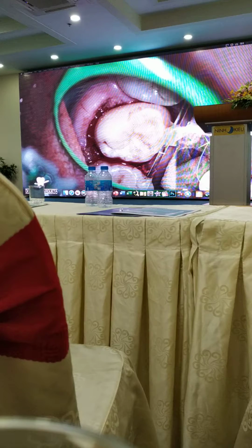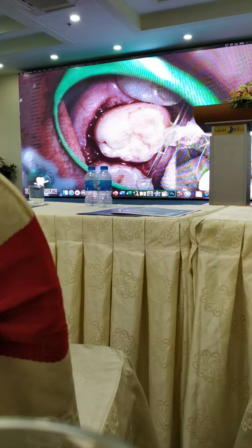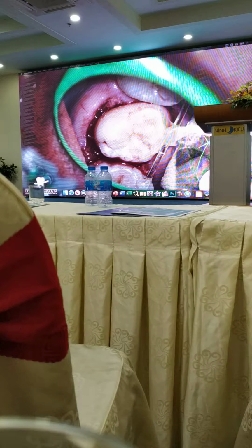So we did that. We splinted the molar in this position for 15 days with monofilament fishing cord. I use fishing cord for doing that. It's really easy to find. If you buy one roll of fishing cord, the diameter should be 1 millimeter. You will have fishing cord for all your life, and if your children become dentists, they will still have the material, because it's a lot, and it's a really good material for splinting because it provides a semi-flexible splint.